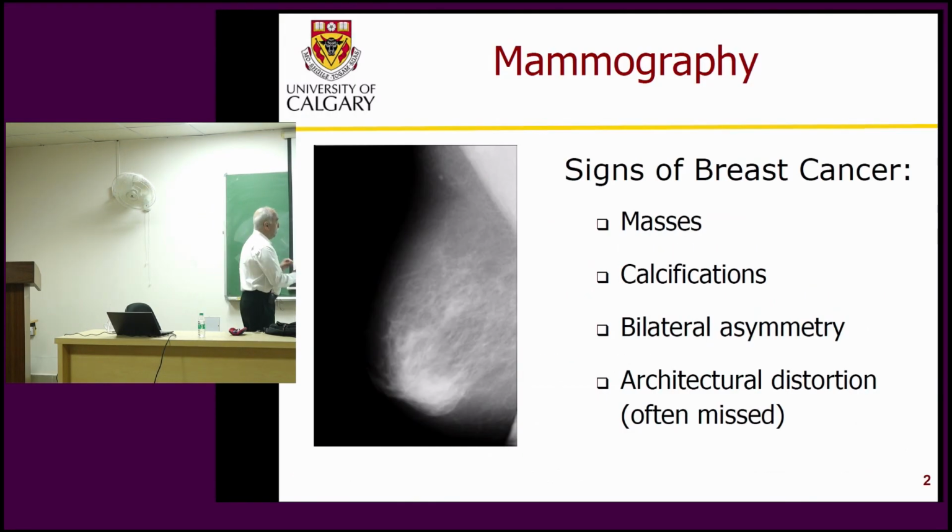So mammography. Mammography was introduced perhaps in the 70s and 80s. When I went to Canada, to Winnipeg in 1981, mammography was still fairly new. It was there, films were there and images were being taken, but screening mammography started in the early 80s to late 80s. And then this was promoted as a method to catch breast cancer early, but in the systems for mammography in the early stages in the 1980s, the radiation dose was substantial, films were not of good quality, digital detectors came only 20 years later.